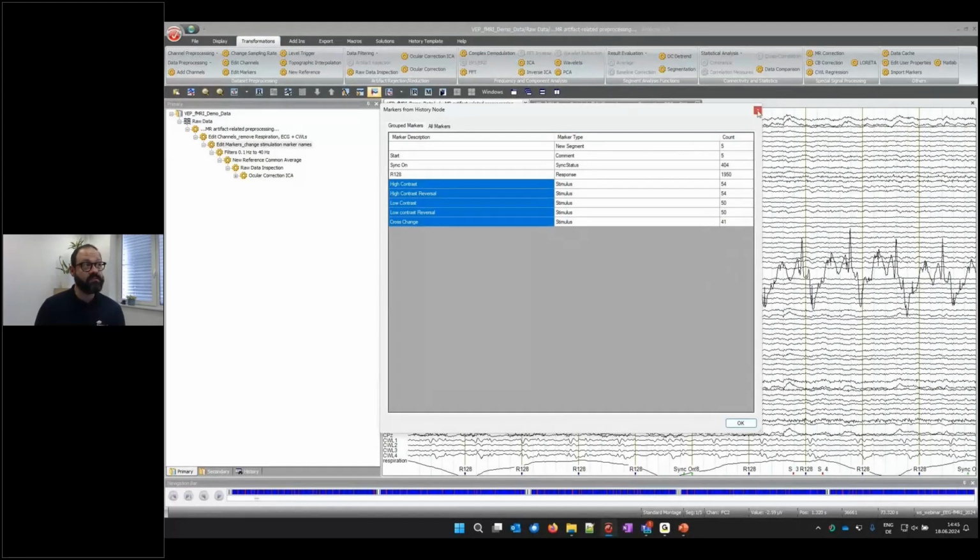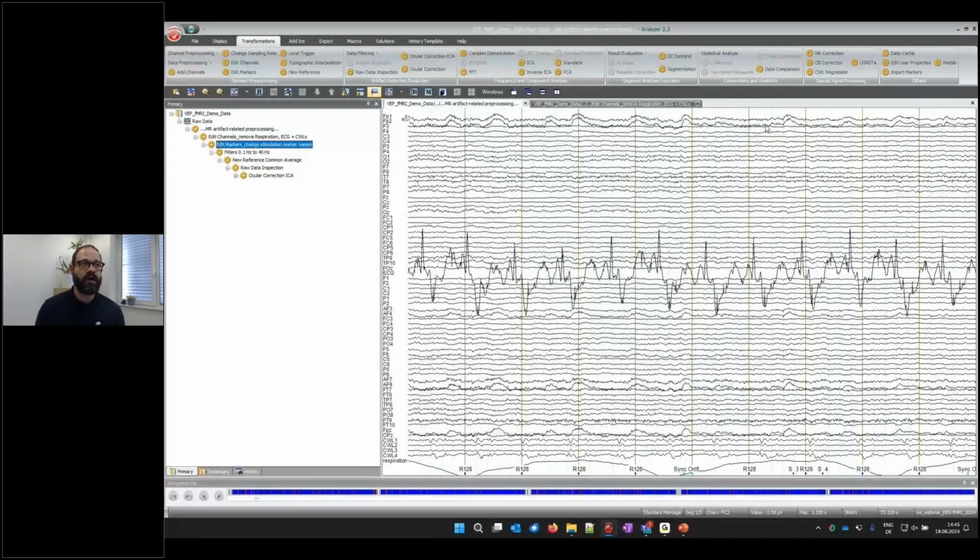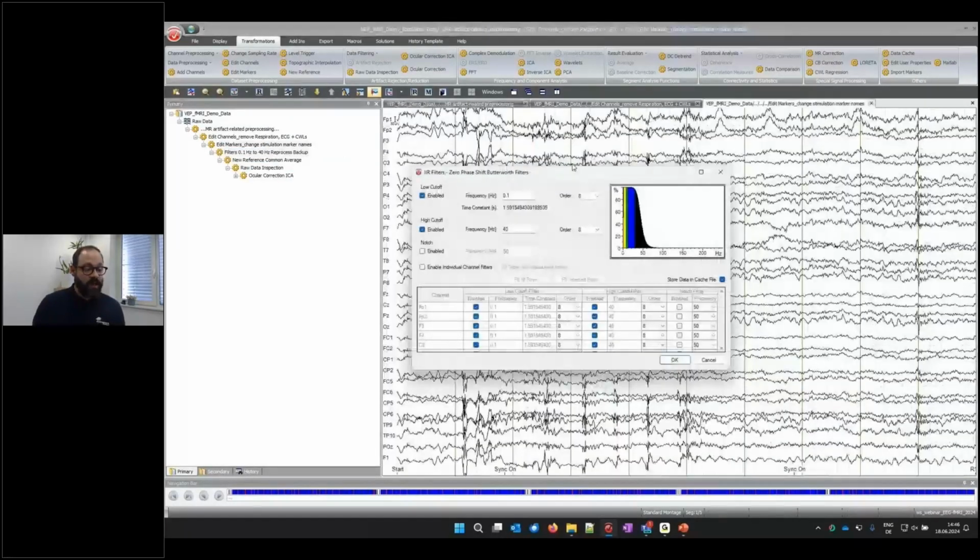Okay, so these first two steps I would rather subsume under we are adapting our data set, our layout, and now we're coming to the actual steps of cleaning the data. The first one is filters, something that is very commonly done. And again, I'm just right-clicking here to reopen the menu so that you can simply see what we have used.